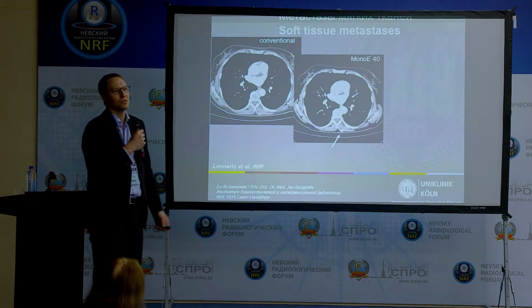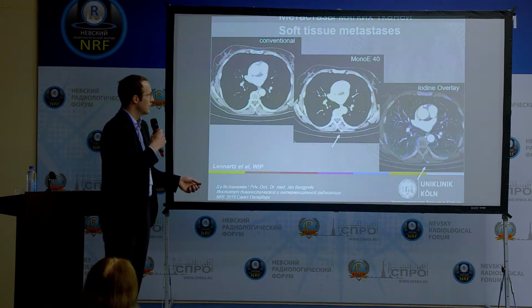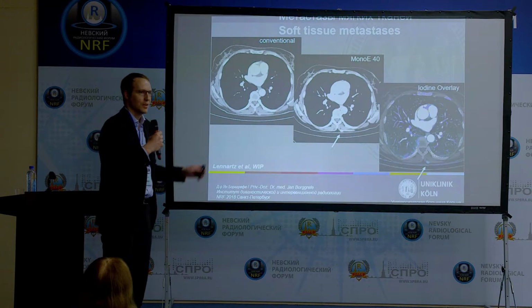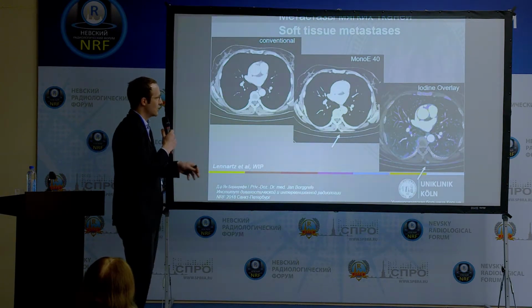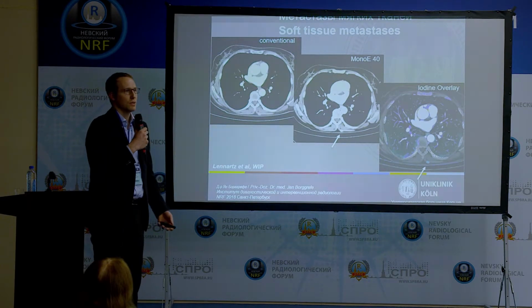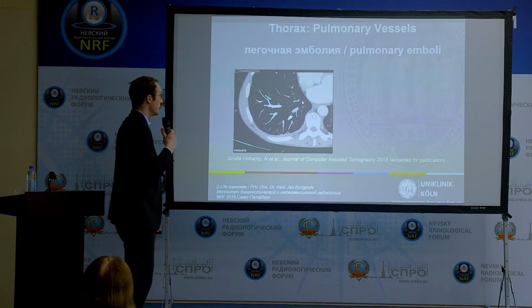Here's a soft tissue metastasis to some more extent, but here it truly helps to use fusion images. And this is also a feature that I really appreciate. You can take the conventional images and then put the iodine map as an overlay to this. You really get a boost of contrast. You cannot miss it anymore. You have some false positives because there are some small vessels that appear as injections into the muscles, but it really helps you to pick up these lesions. And in a melanoma patient, this could be really of importance, because we know that in melanoma patients we have to resect all tumors that we can in order to improve the outcome with the current immunotherapies.